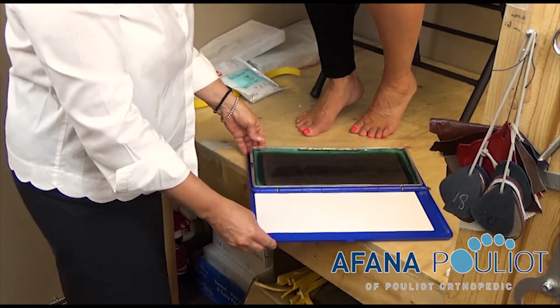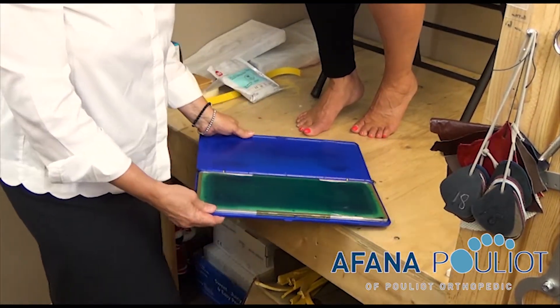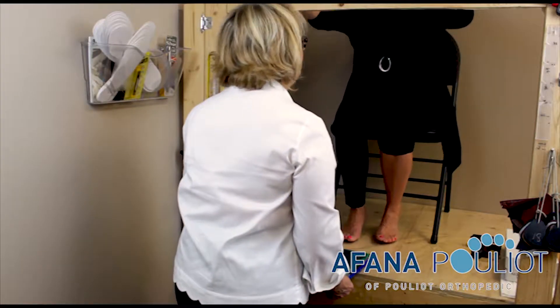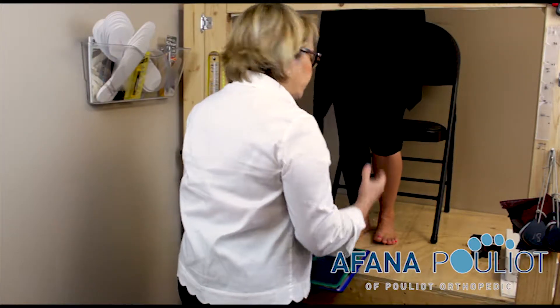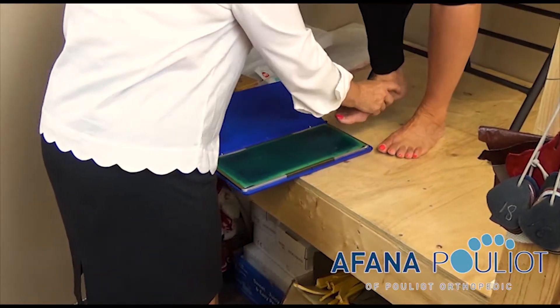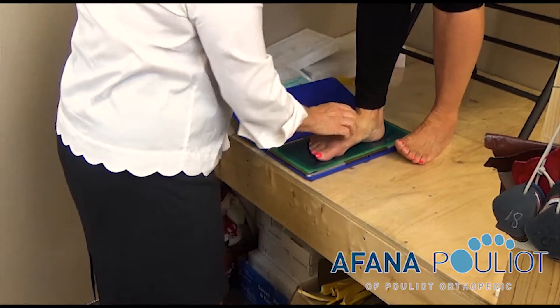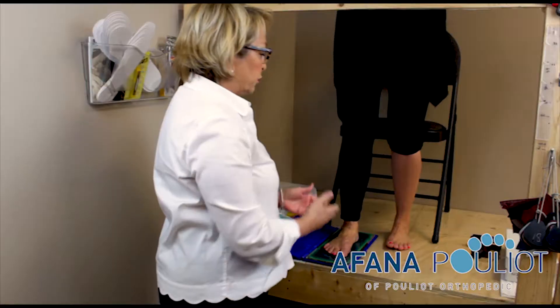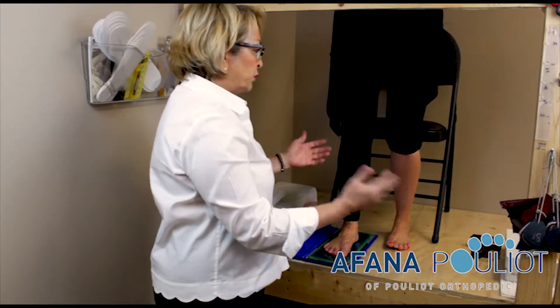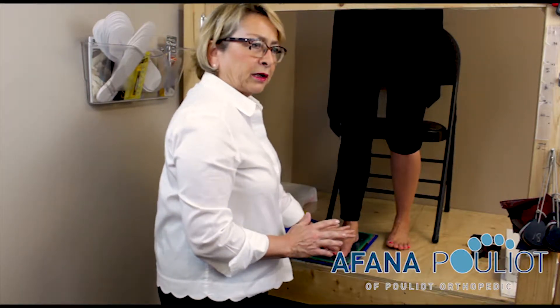Once this is done, you just close the pad, and then you ask your patient to stand up. It is important to guide the patient's foot, placing it as much as possible in the middle of the pad, and then you ask the patient to spread their weight equally between both legs, and then the foot is going to make the impression.